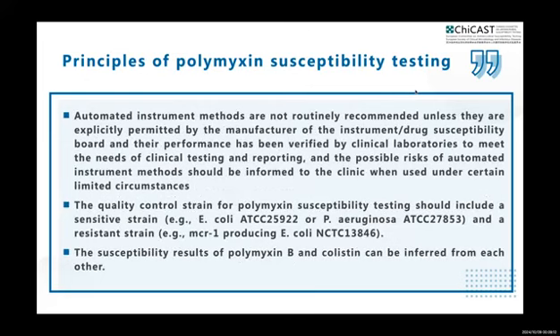Automatic instrument methods are not routinely recommended unless they are explicitly permitted by the manufacturer of the instrument and their performance has been verified by clinical laboratories to meet the needs of clinical testing and reporting. And the possible risk of automatic instrument methods should be informed to the clinic when used under certain limited circumstances.